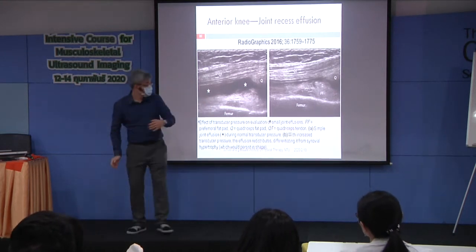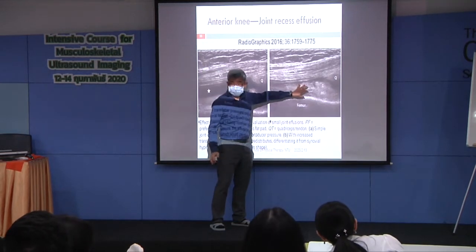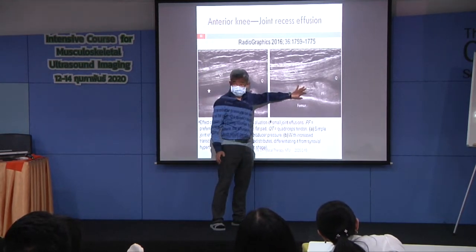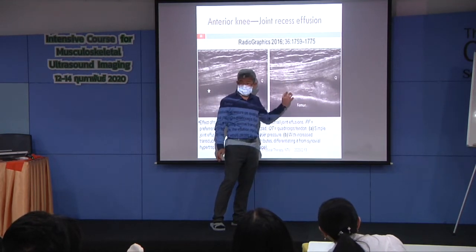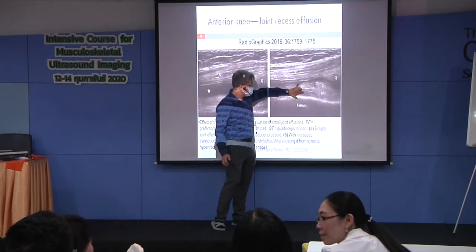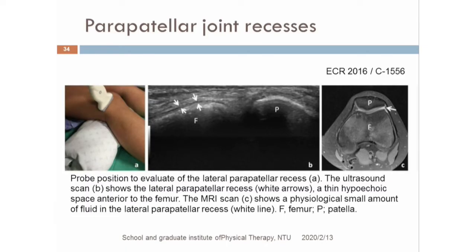Okay, so reducing the thickness of the synovium is very important. So my colleague used shortwave treatment. Two months after, the thickness reduced. Okay.